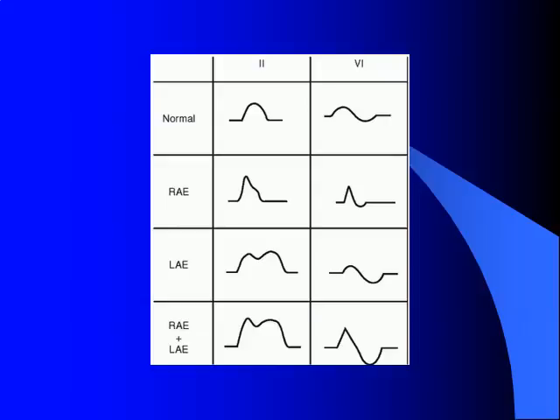What we have in the second box down, which is going to be indicative of right atrial enlargement, is what we call P pulmonale. Right atrial enlargement is usually caused by pulmonary hypertension, people with chronic lung problems, etc. So what we're looking for is our peaked P waves in V1 and lead 2. Usually peaked is they're going to be a couple millimeters high as opposed to our general where it's just half up to a millimeter or millimeter and a half in height. We're going to see them a lot taller. They come to a point instead of our normal rounded upright morphology.